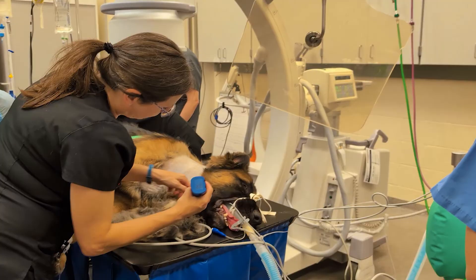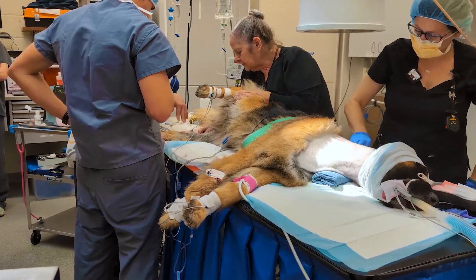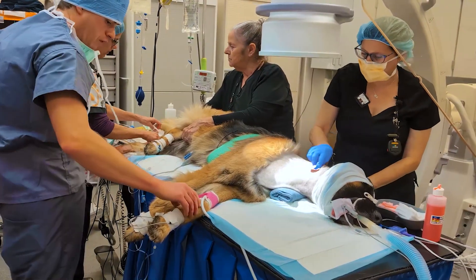We will then prepare for surgery, which involves him laying on his left side on the table, clipping and shaving, and then cleaning his neck with a sterile prep for surgery.